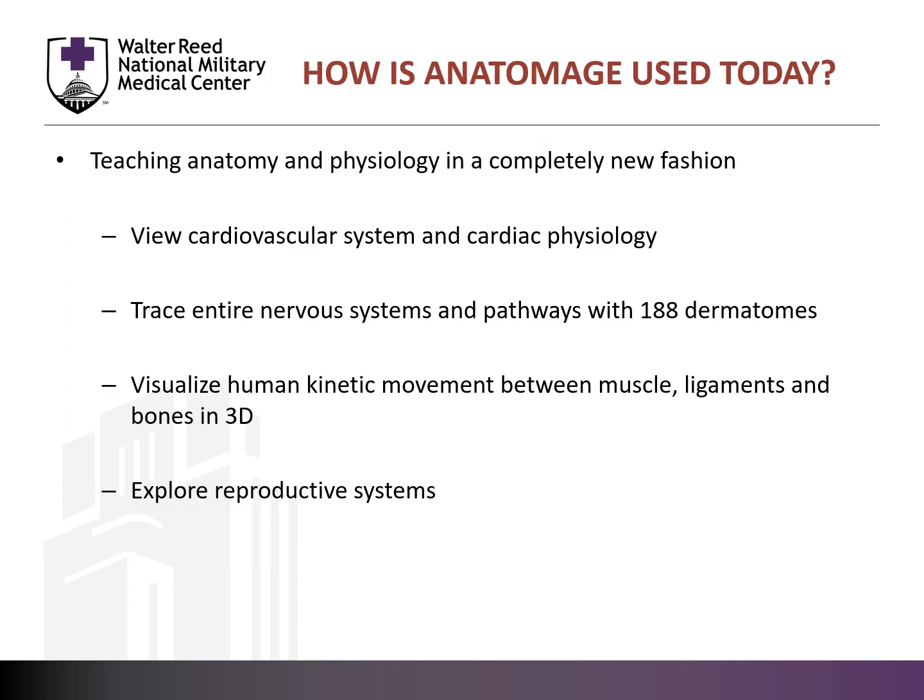The Anatomage table has revolutionized the way we can teach anatomy and physiology and made education more efficient. The table is used in anatomy labs today as students are dissecting their own cadavers, or as surgeons are preparing for a case. Students can study the organ systems, both their structure and physiology, at the same time. Learners have access to the case library, which contains numerous case studies with associated pathologies.